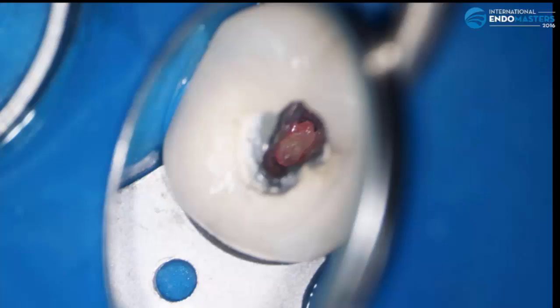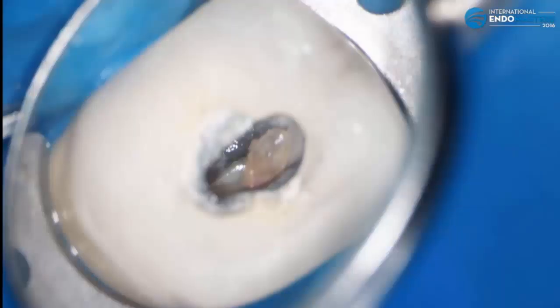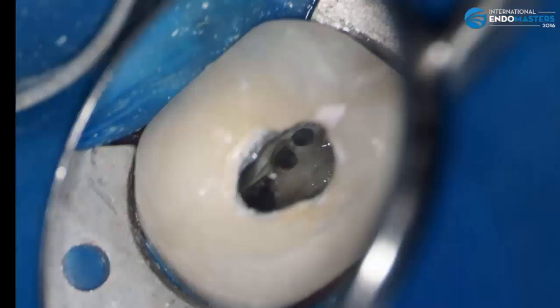When I started the access, I found a pulp stone that I removed with ultrasonics. At this point, I was able to remove the stone. First of all, I was very surprised that the tooth had two distobuccal canals. I started to search for the remaining canals and later found two more mesiobuccal canals for a total of 5.